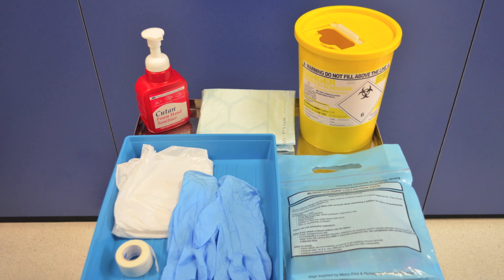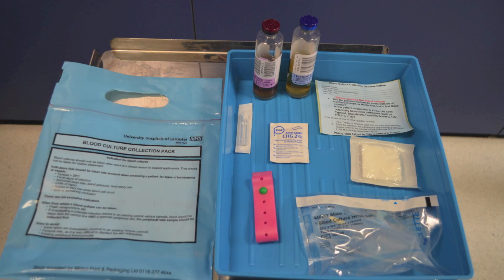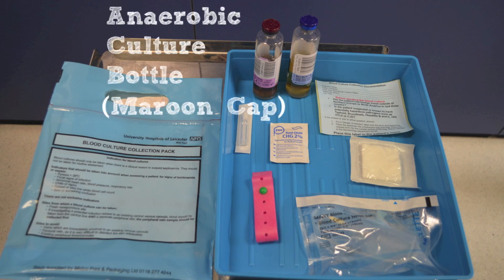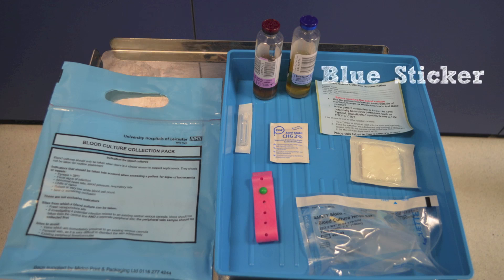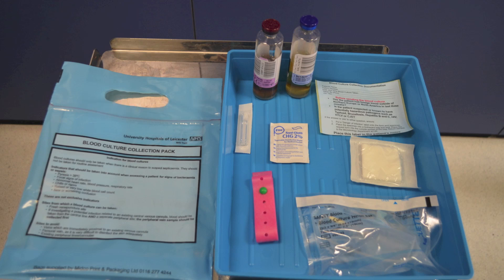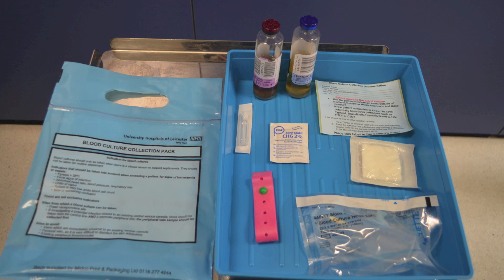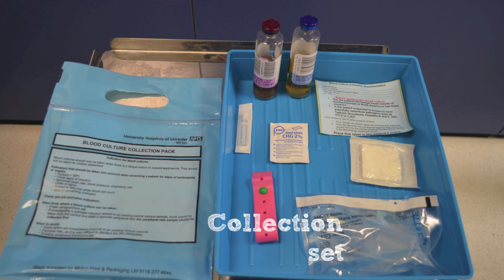You will also need tape and a blue blood culture collection pack. The contents of the blood culture collection pack consists of a blue-capped aerobic culture bottle, a maroon-capped anaerobic culture bottle, a blue sticker for documentation, chloroprep for decontaminating skin, a chlorhexidine wipe for cleaning the blood culture bottles, sterile gauze, a disposable tourniquet and a collection set including the butterfly needle.